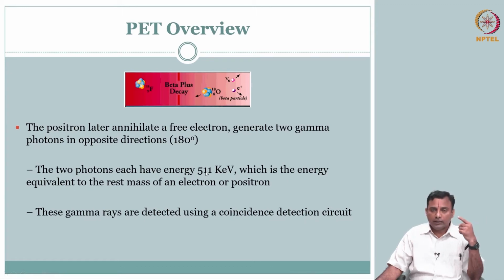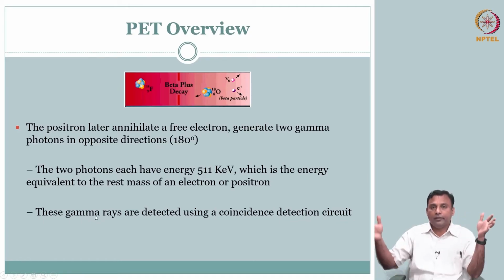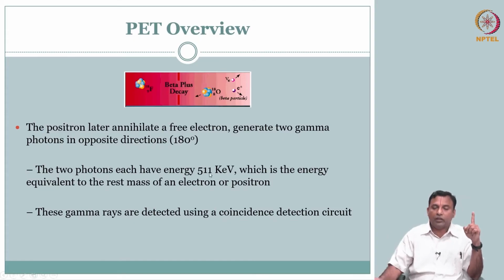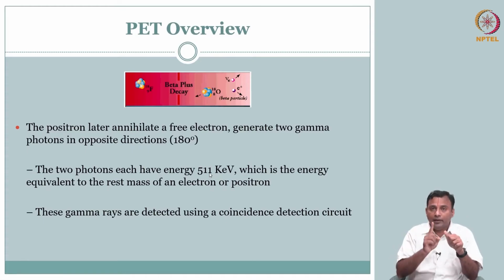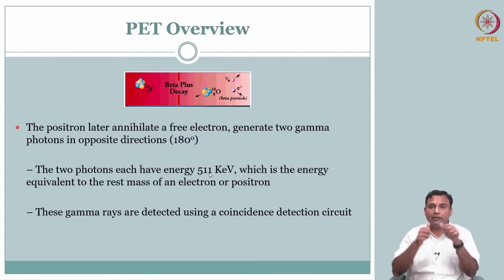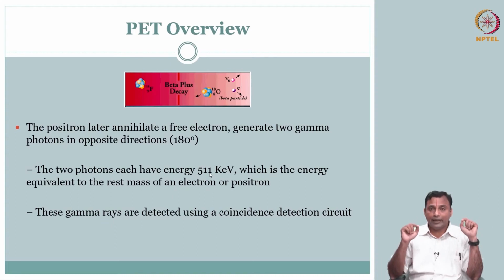So the important detail in positron emission tomography is that here also you are ending up detecting only the gamma photons. However, it has a specific energy which is 511 keV, and more importantly, if one decay happens, you are going to record 2 photons at 511 kilo electron volts that are exactly in line, that is exactly 180 degrees in direction, and that is key information.